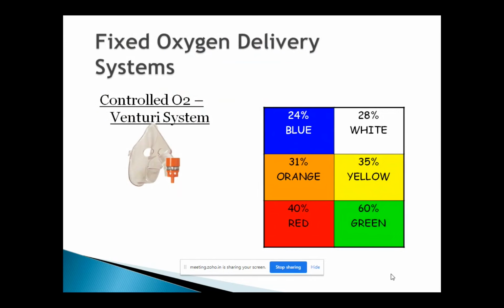As I said, the FiO2 you can give using the fixed devices only varies from 24% to 60. You cannot give anything more than 60%. Why is that? Because to give 60% oxygen, you have to set the flow meter to 15 liters. I already told you in the beginning of the presentation, the flow meters we use in the hospital have a maximum capacity of 15 liters. That's the reason the Venturi valves are capped to give 60% maximum with the 15 liters flow.